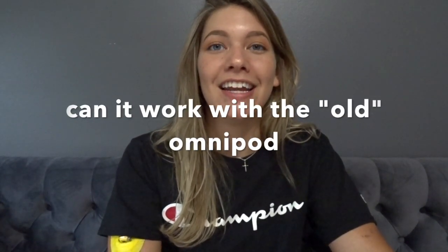The next question is, can it work with the old Omnipod? And yes, it can. Loop can work with the Medtronic pumps and the Omnipod. It cannot work with the Omnipod Dash because that just came out and they have not set it up. I actually think the Omnipod Dash has different pods, so it won't work at all. But it works with the Omnipod and the older Medtronic pumps, like from around 2010 or 2012. That was the first pump that ever looped, and Omnipod just became a thing last year or something.